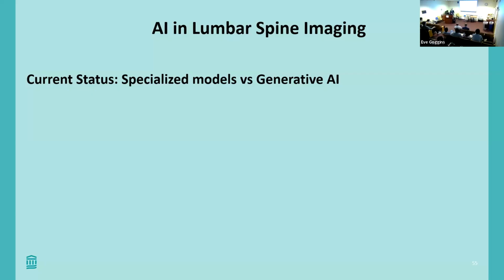You have to have a lot of images, have them all labeled by experts, or take the data from reports, put it into a box with a lot of GPU horsepower, let it cook for several days, and you have your model, test your model. There's a lot of papers like this.